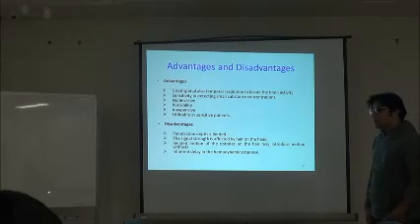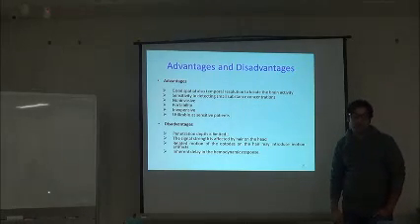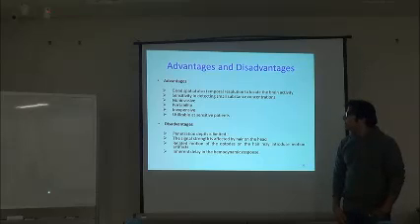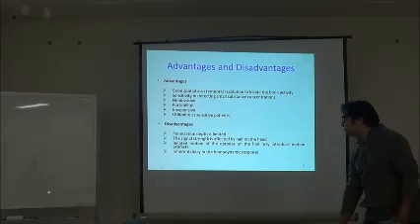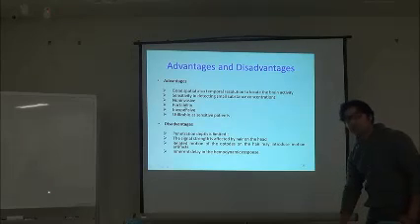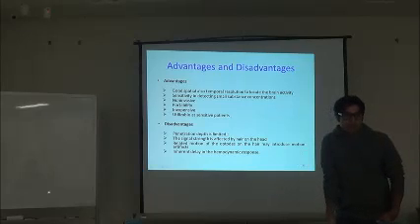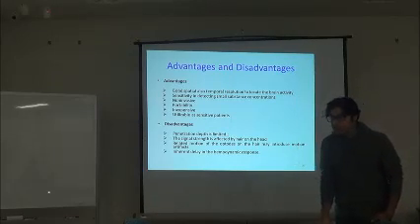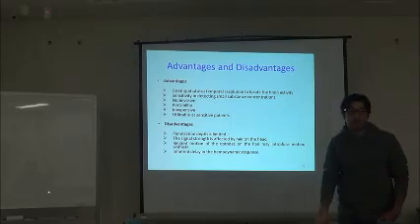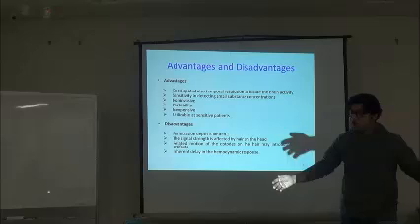Well, at the end, I will describe some of the advantages and disadvantages of using fNIRS. The best advantage is that it's non-invasive and it's portable. What do you need for a brain-computer interface system? It should not be invasive. You don't want to cut open the brain of a subject. And secondly, it should be portable. Wherever you go, it can go with you. It's not like we have to sit at some machine like fMRI. It's a huge one.